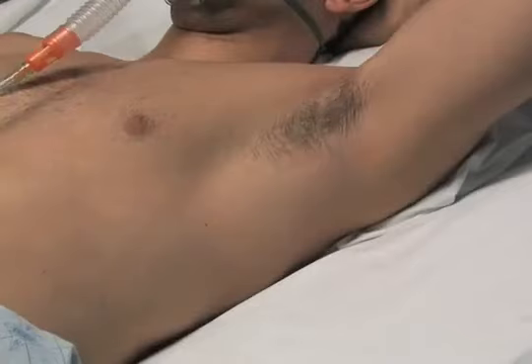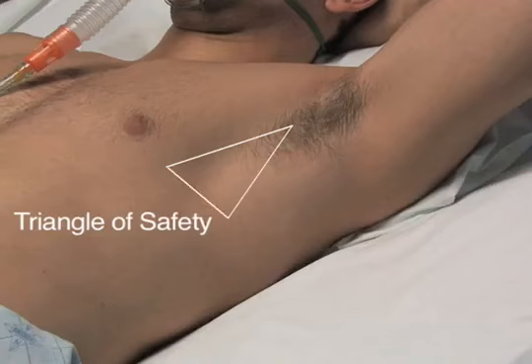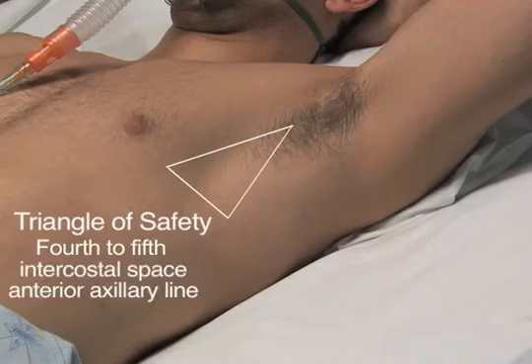The ideal location for the placement of a chest tube is in the triangle of safety, the anatomical region defined by the lateral border of the pectoralis major muscle anteriorly, the mid-axillary line posteriorly, which is also the anterior aspect of the latissimus dorsi, the apex just below the axilla, and the horizontal level of the nipple inferiorly. The nipple line may be an unreliable landmark for female patients due to breast tissue. To help with landmarking, remember that the triangle of safety should approximately lie between the 4th and 5th intercostal space in the anterior axillary line.